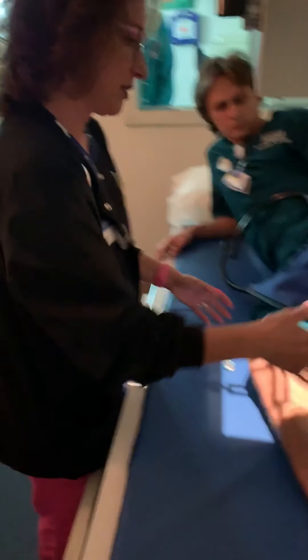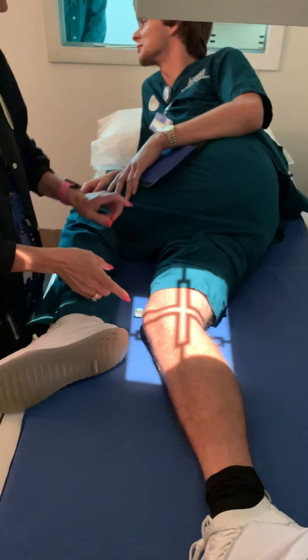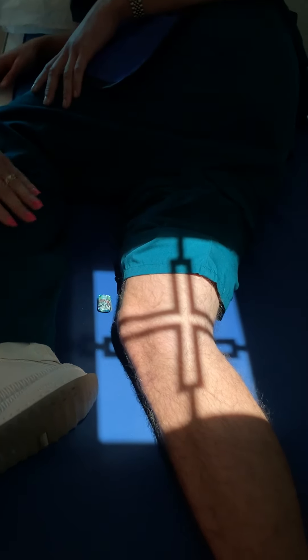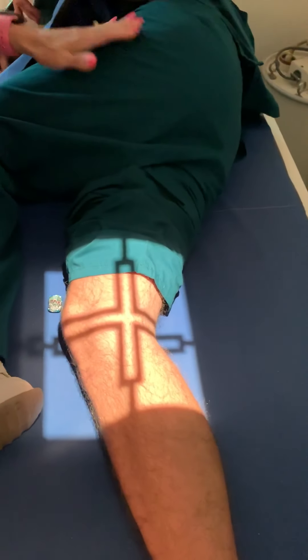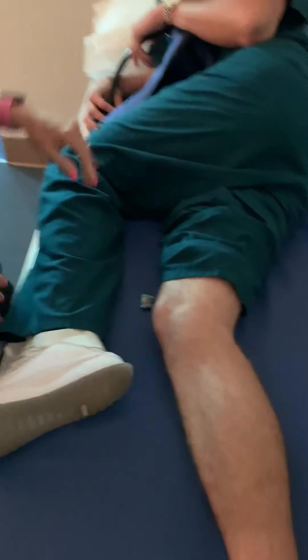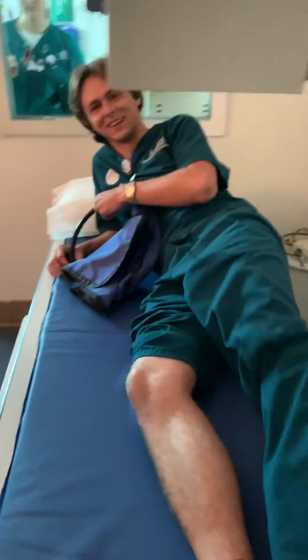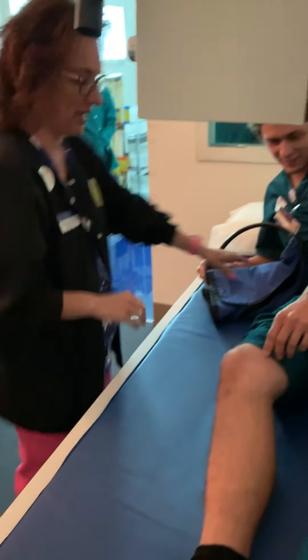The only thing I want to caution you — sometimes the text will have you bring this leg over and roll that knee over. When he did that, he did not move and his patella is still perpendicular. The problem is most people, especially women, when they do that it's going to over-rotate and turn the leg. Most people can't maintain that when they get into their 'sexy kitten pose.' Alright, lay back on your back — you can stop.